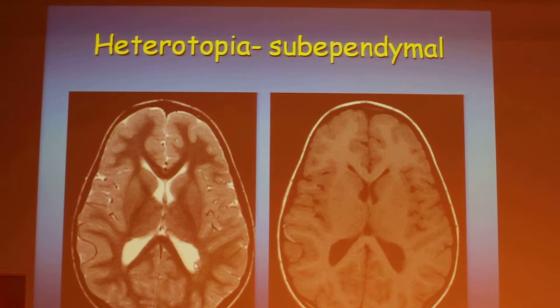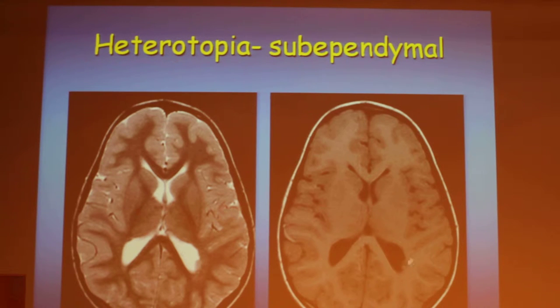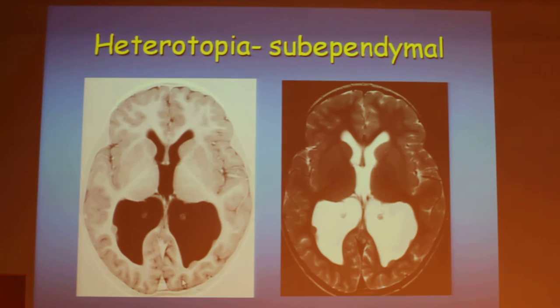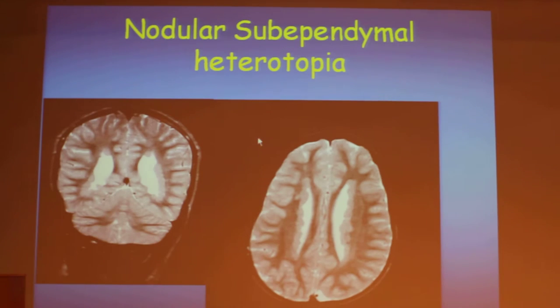What we have to check is if this nodule has an appearance of gray matter in all sequences, just to prove to ourselves that it is a heterotopia and not another abnormal sub-ependymal nodule. It can be one or can be multiple, as in this case.